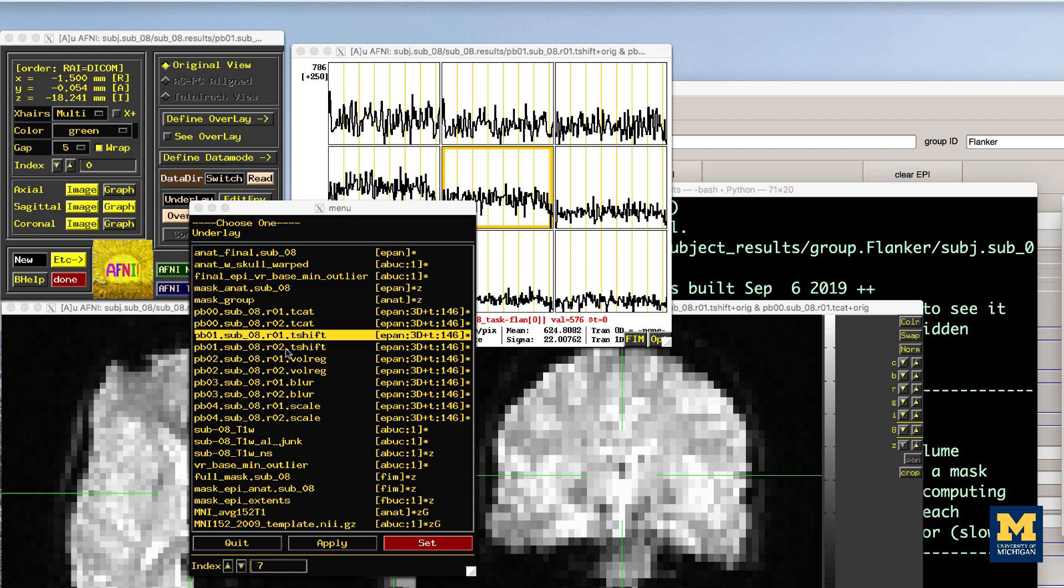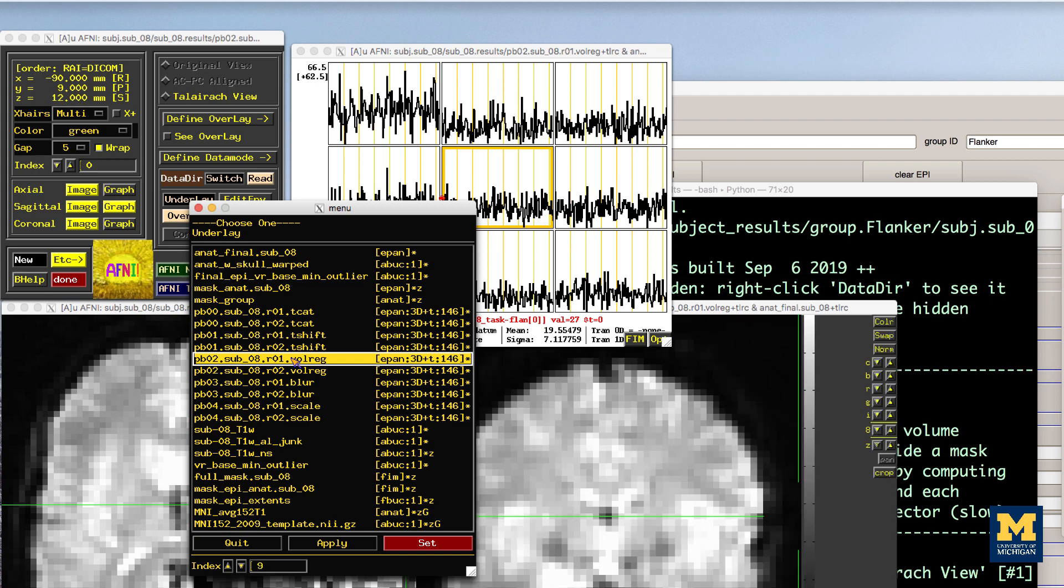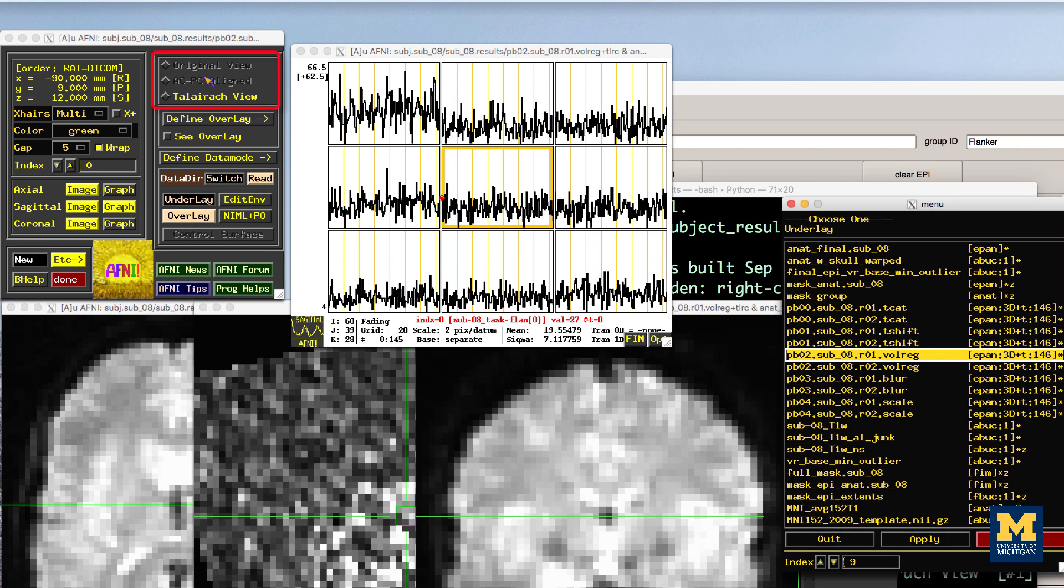The next file to look at is the pb02 volreg files, which have been motion corrected, co-registered to the anatomical image, and warped to a standardized space, which in this case was the MNI 152 template. If you click on the pb02 images, the view changes from original view, or the raw data space, to Talairach view, indicating that these images have been normalized.